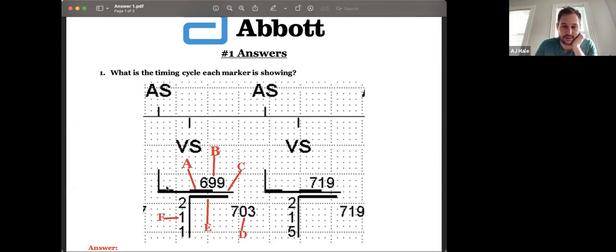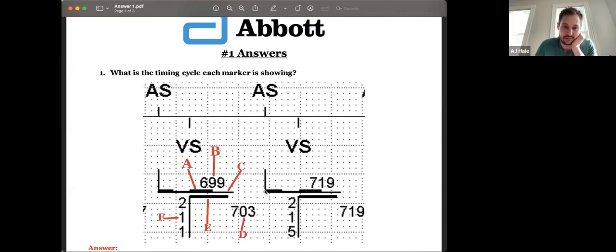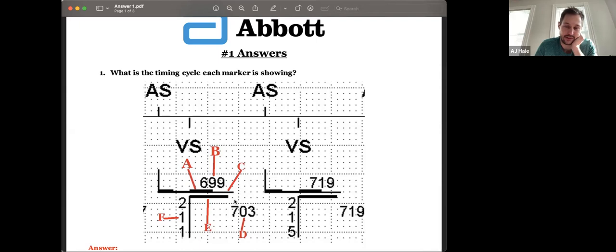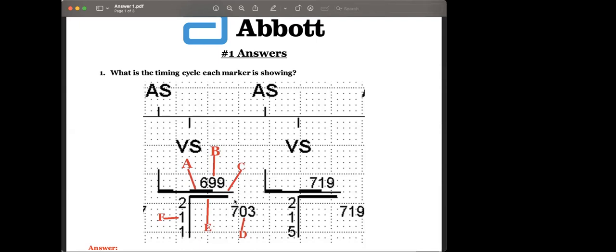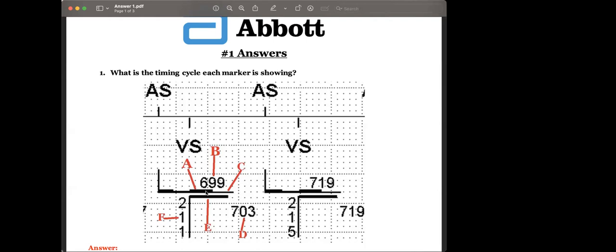I kind of educated guess, but I thought A was looking at that thick black line. Mm-hmm. I thought maybe that was PVAB. Yes, sir, so post-ventricular atrial blanking. I thought B was perhaps your A to A timing. That is correct. C, I assumed it was the top. Yeah, so this is actually PVARP, but technically it's also TARP.